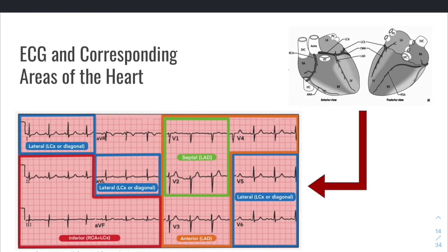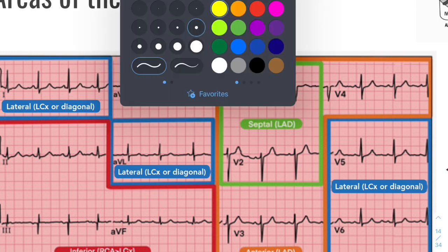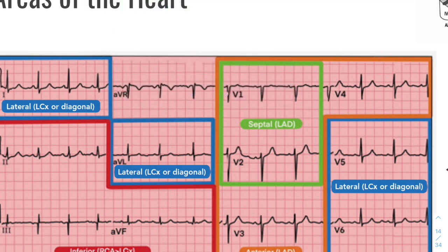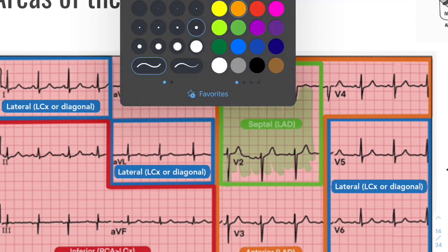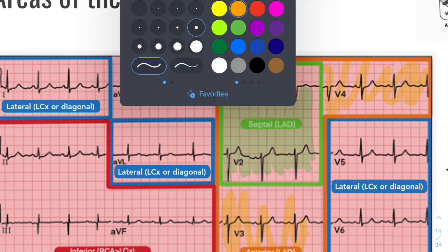And this is further dissecting that upper portion where you're looking at your chest leads and your limb leads. And I just like to point out, again, like we said, there are certain coronary vessels and blood vessels that supply certain areas of heart muscle. So in V1 and V2, you're looking at mostly septal leads, but that's still your LAD, whereas V3 and V4, in addition to V1 and V2 as well, are pointing out anterior leads. So again, that is LAD territory.